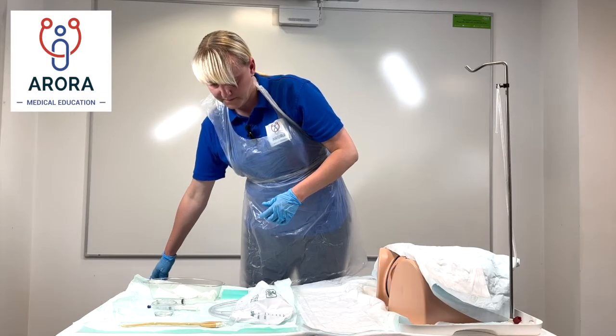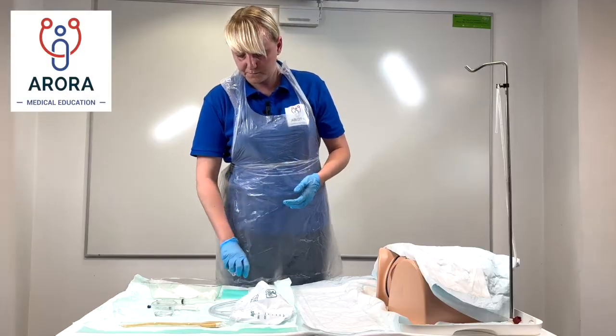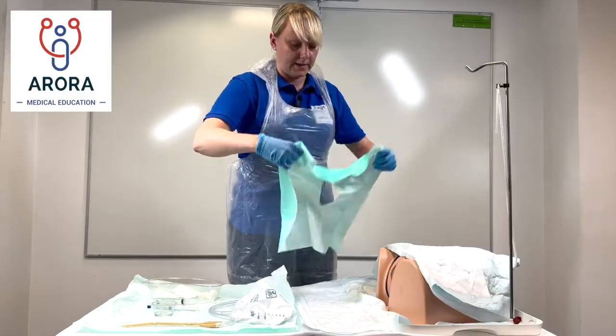That's done. I'm going to change my gloves — new pair of sterile gloves at this stage — and I'm just going to put this drape over you now just to keep everything clean.